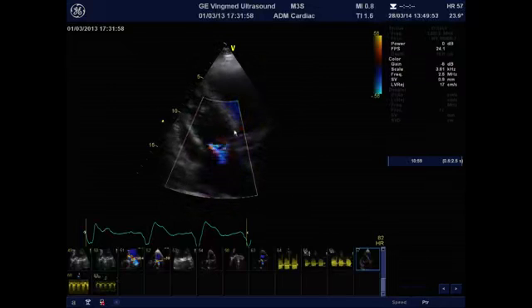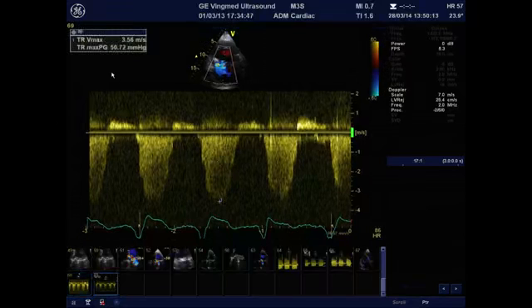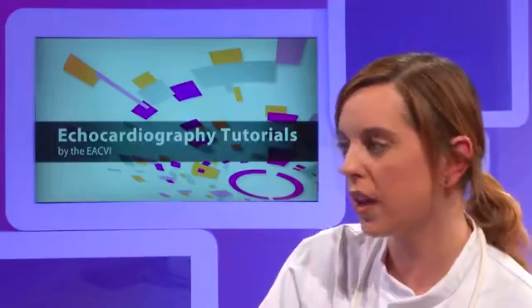Here you can see the septal movement first, that corresponds to probably a severe pulmonary hypertension. Also using the transtricuspid regurgitant jet, you can measure the transtricuspid gradient, and with the measure of the max velocity, you obtain a transtricuspid gradient of 51 millimeters of mercury, which corresponds to pulmonary hypertension. So now let's move on to the third case.